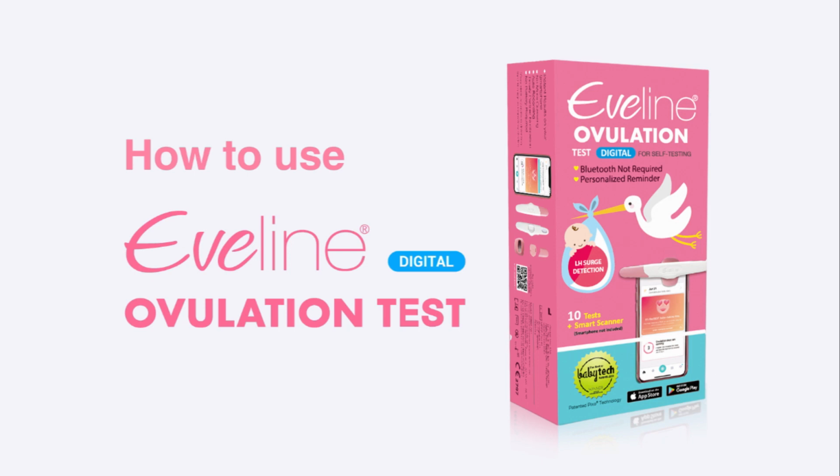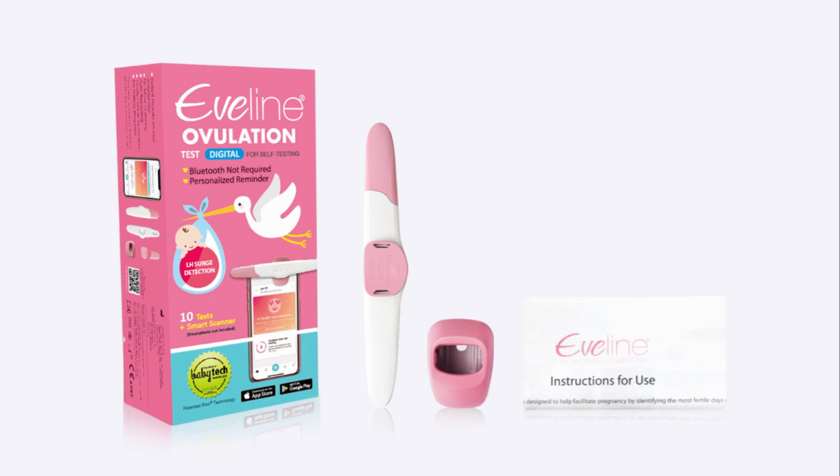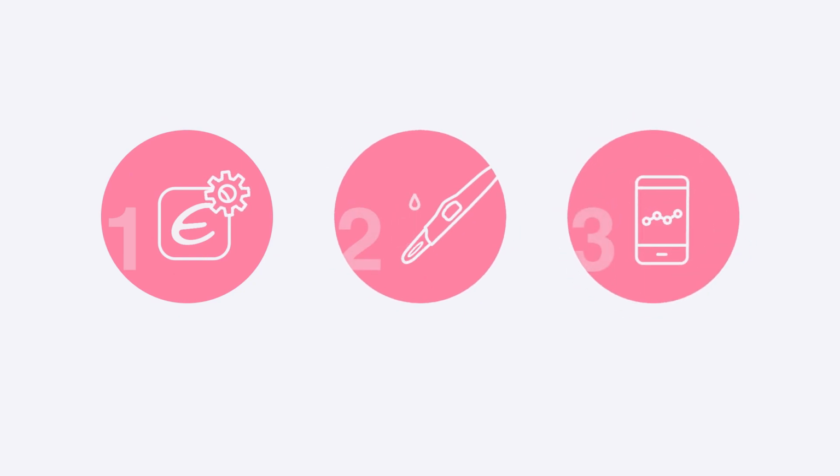How to use the Eveline ovulation test. Each box contains ovulation test strips, a smart scanner, and an instruction manual. Using Eveline is as easy as 1, 2, 3. Set up the app, obtain a urine sample, and let your smartphone analyze the results.